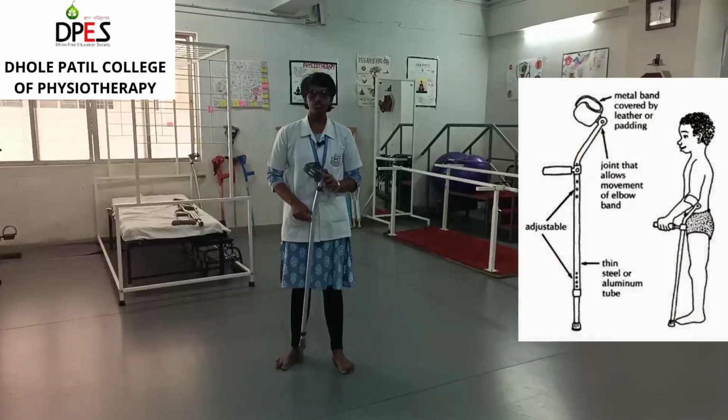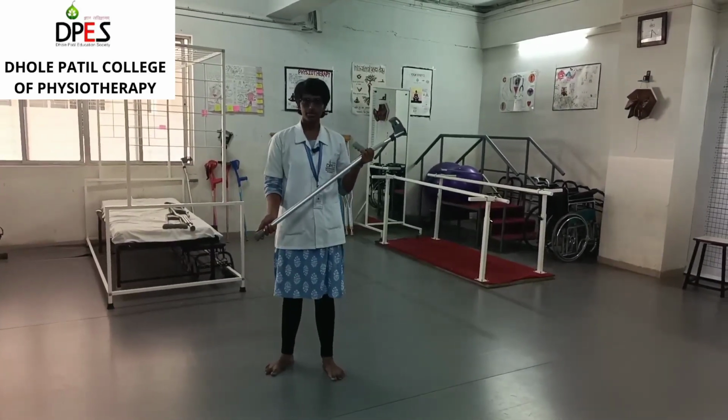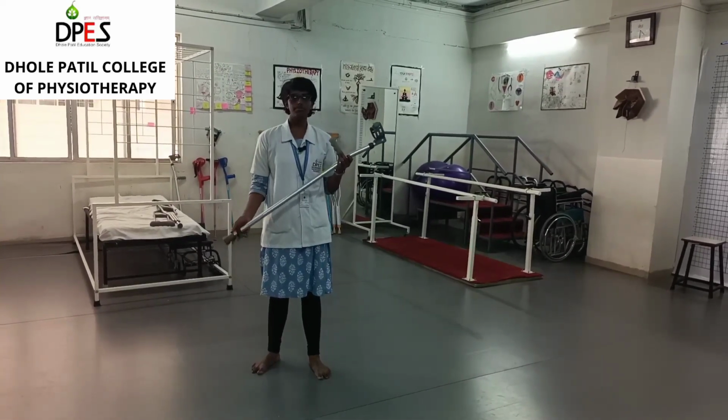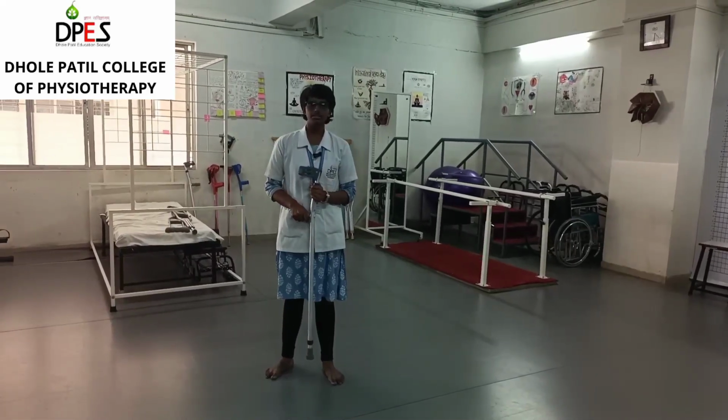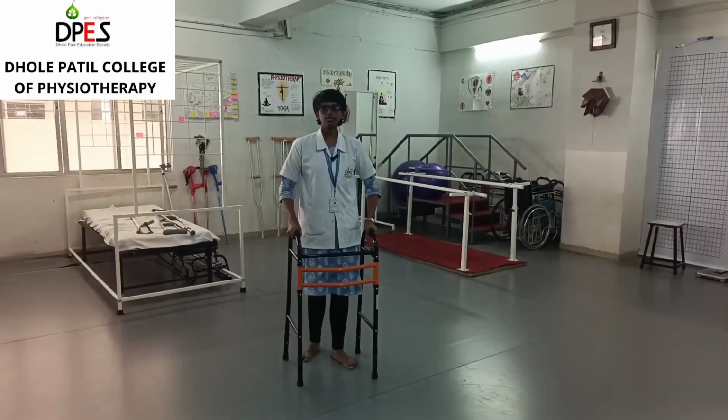This is an elbow crutch. The parts of the elbow crutch are the arm cuff, the hand piece and the rubber ferrule. So the height of the rubber ferrule and hand piece can be adjusted with these knobs according to the patient's convenience. These are known as frames.